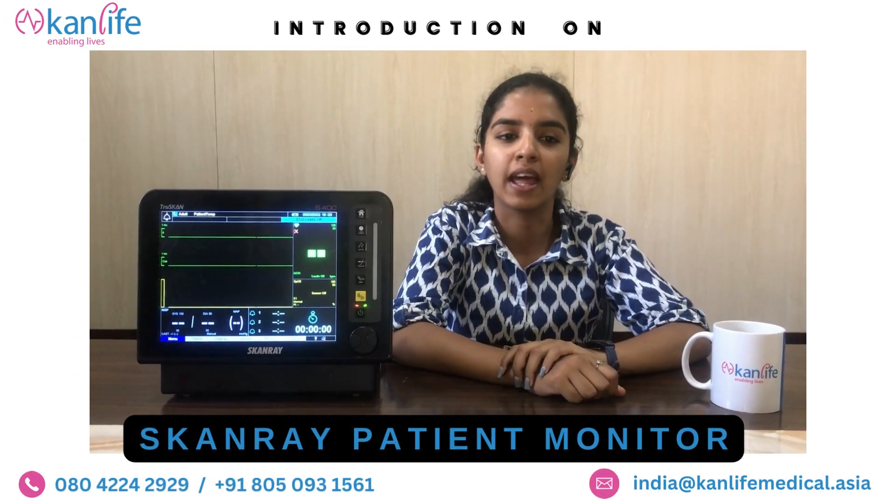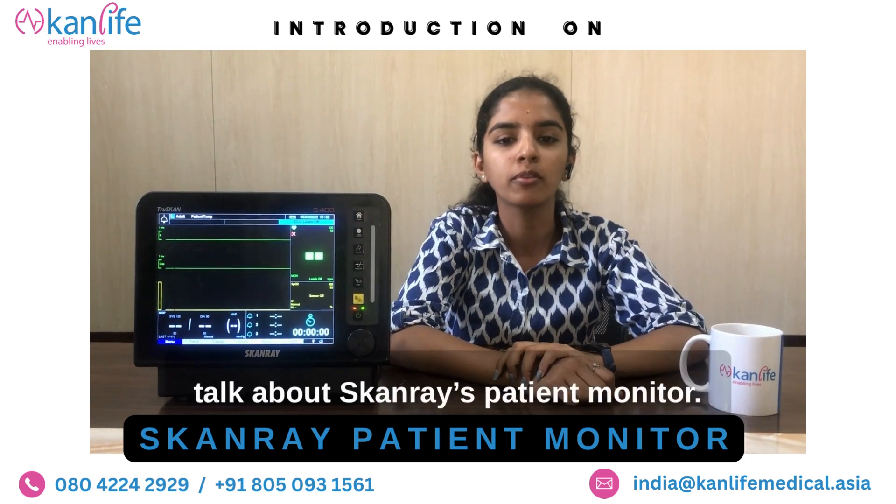Hello, myself Vikashni from Kanlife. Today I am going to talk about Skanray's patient monitor.